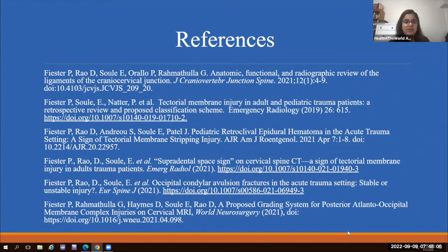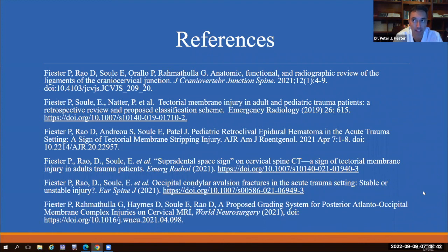While we are waiting, I just wanted to comment how excellent the case images were, and how you had highlighted each image with arrows, and at the same time you had put the anatomy image to correlate both of them. It's very important because the MRI of the spine, especially the ligaments, could be so confusing. Yeah, it's confusing to most radiologists who are done with training. Like I said, it's a little bit of an ignored area of the body, which is to me kind of baffling because it's so crucially important for survival to have those ligaments intact.